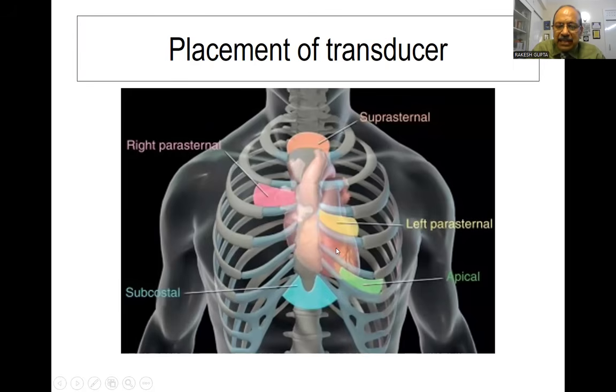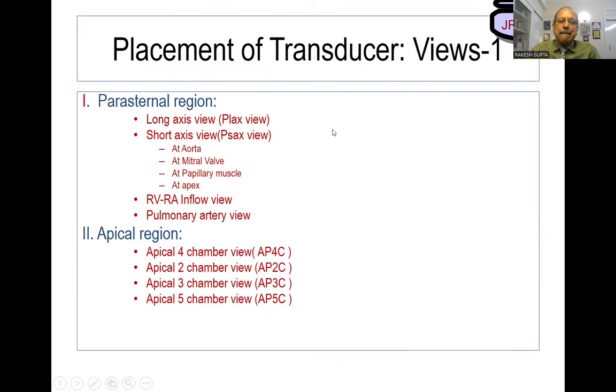You go to the apex, left fifth intercostal space, index marker at 2 or 3 o'clock position, and we are as parallel to the heart as possible. Then the subcostal window. Right parasternal: right second intercostal space, index marker facing roughly 1 o'clock. Suprasternal: index marker at 3 o'clock position. We are right in the suprasternal window. We'll repeat this again and again as things come back.